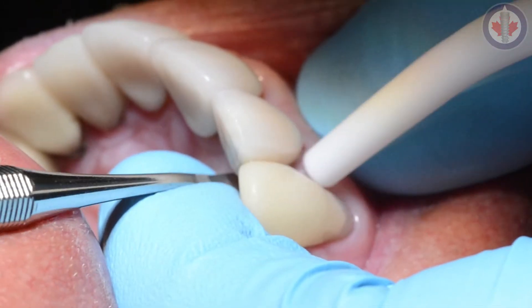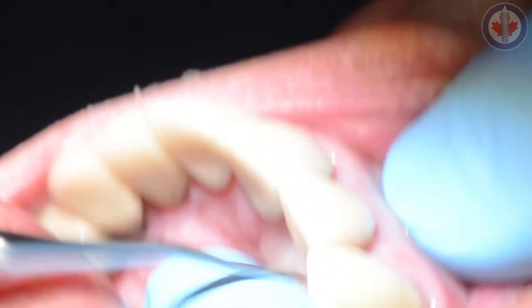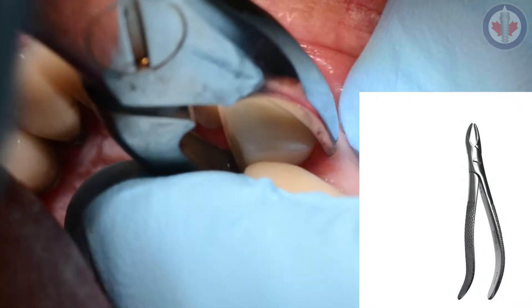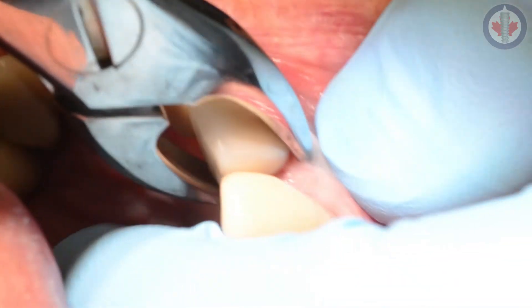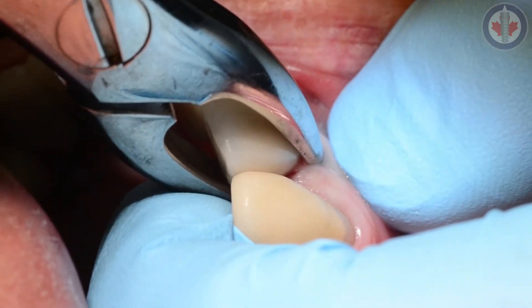Some of the principles required here are atraumatic extraction, absence of infection or pathology, and adequate soft tissue coverage. In this particular case, we're going to try to get this tooth out without fracturing the buccal plate. We're using a Woodson Elevator, which you can purchase from either Premier or Euphredi — an excellent instrument to detach the periodontal ligament from around the tooth. I'm also using a 76S forcep, one of my favorite forceps for taking teeth out. It has beautiful small beaks that engage the root, and we'll show you a picture of how this forcep engages the root.